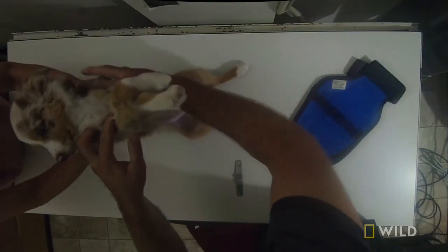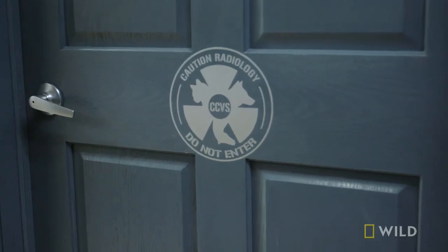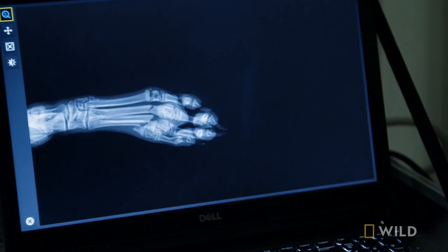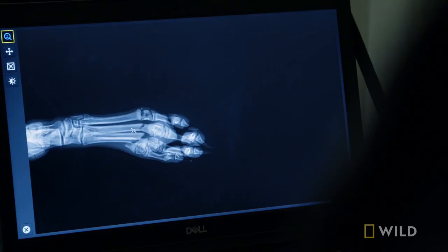Can you sit him up and shoot it like this? There it is — it's fractured. These long bones right above the paw, they're called metatarsals, and three of them are fractured. No wonder you can't use your paw.